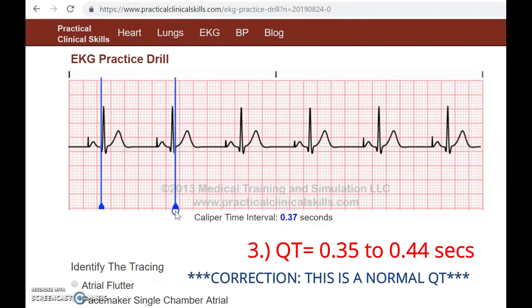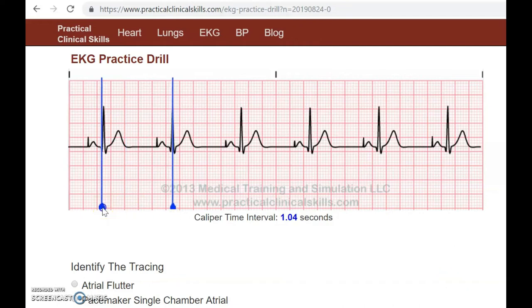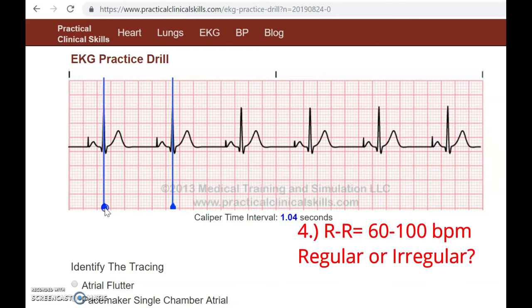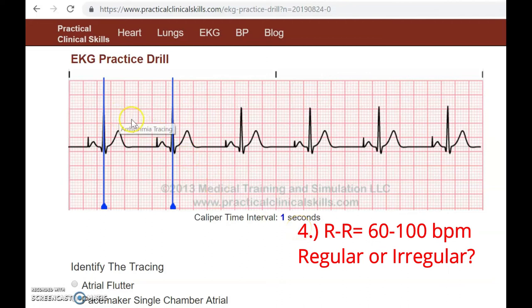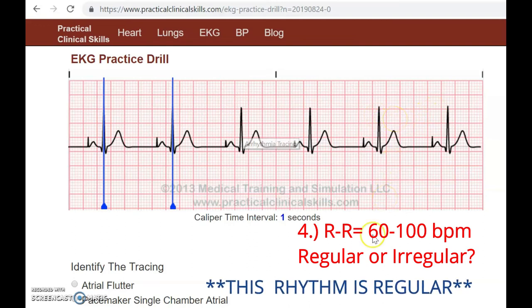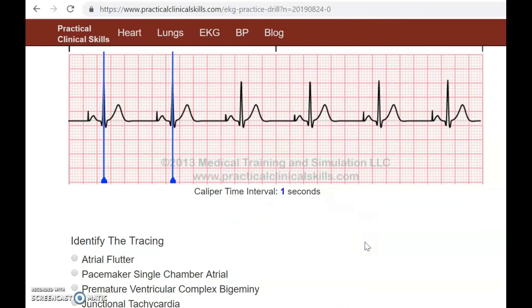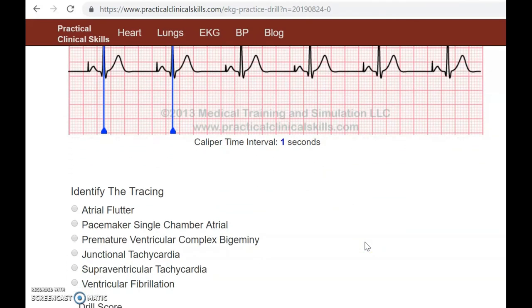Now we measure our R-to-R, which gives us our rate. Our R-to-R is one second, and usually when you're measuring R-to-R on the monitors it's going to tell you the actual rate. You can count the boxes and use those methods, but this is basically 10, 20, 30, 40, 50, 60 beats per minute. This is about 60 beats per minute, which we know is a normal EKG — normal sinus rhythm.